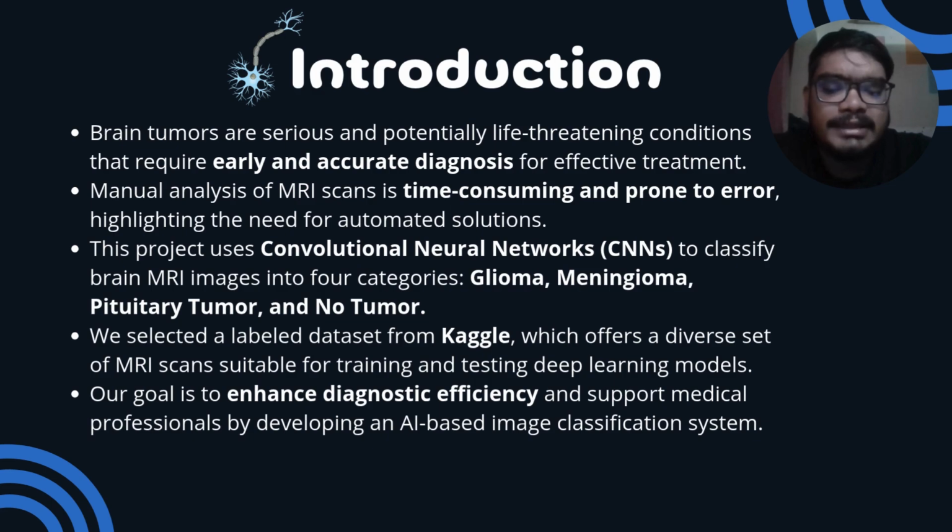We used a publicly available dataset from Kaggle, which includes thousands of labeled MRI images categorized into four classes: glioma, meningioma, pituitary tumor, and no tumor. This dataset provides a solid foundation for training and testing our model.